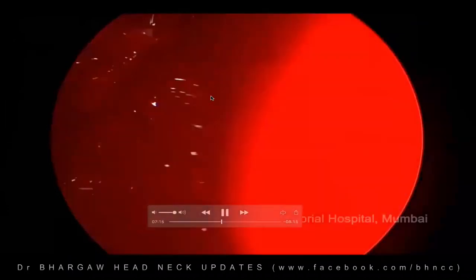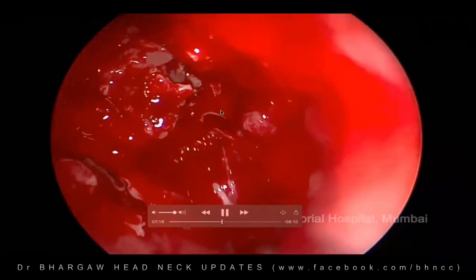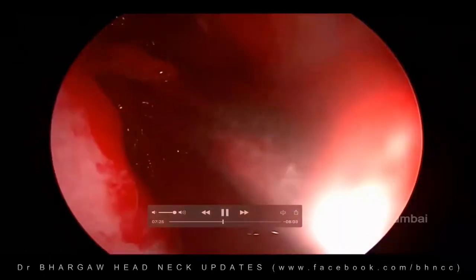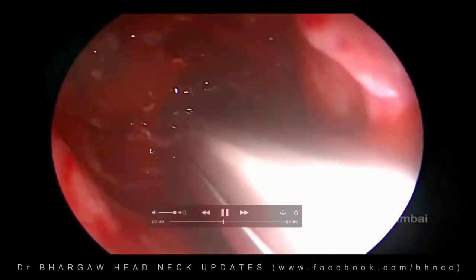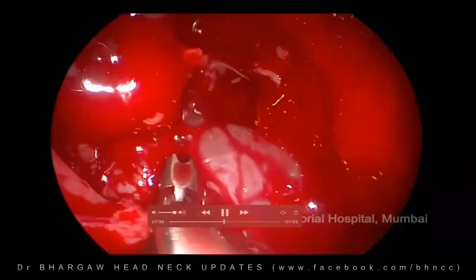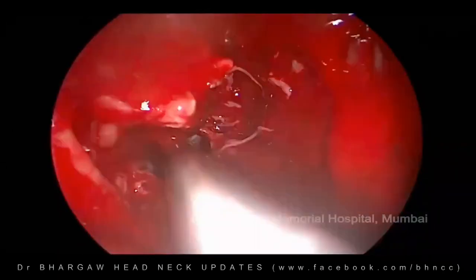You can see the Onodi cell here as we go posteriorly. And then we're just trying to remove all the tumor, debulk it, so that the tumor can be removed superiorly with whatever has been cleared so far. That will be seen in a while. So that's the sphenoid sinus here. The sphenoid mucosa has been removed fully there. You can see now things are better.